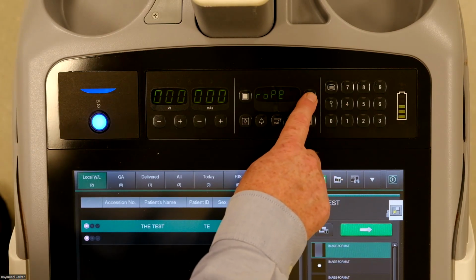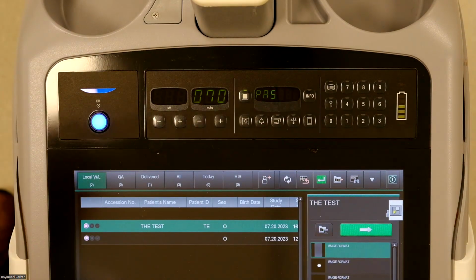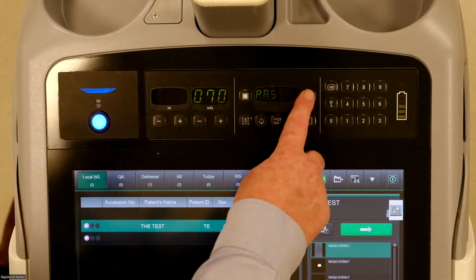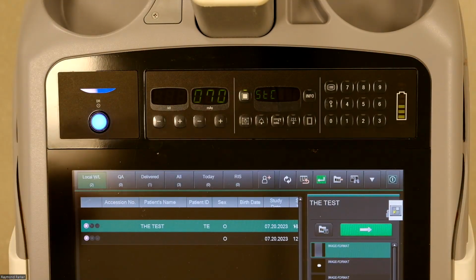And that is about all on the user settings that I think anyone would need to go to. If you do need an adjustment in the top speed or steering control, again, I'd work with service to make those changes. I do want to bring your attention to this PID stuff once again.